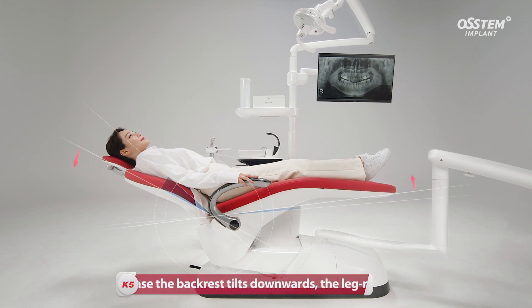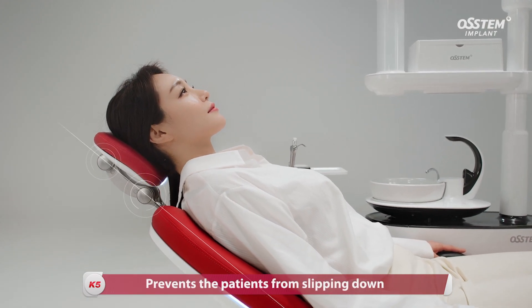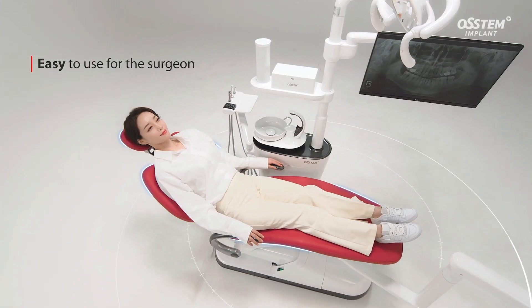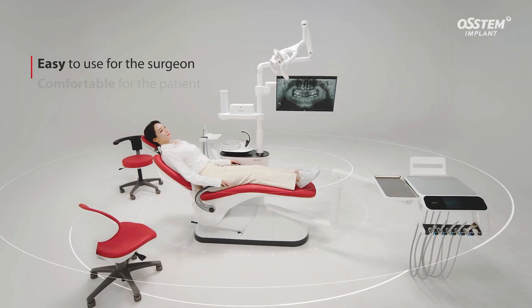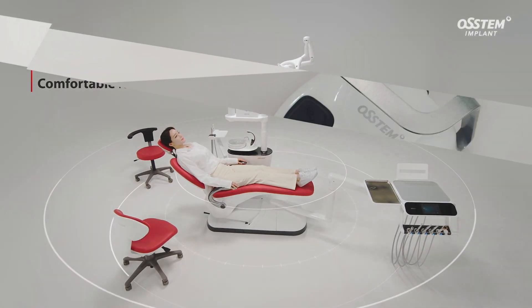When the backrest tilts downwards, the legrest goes up. This tilting function prevents the patients from slipping down. It is convenient for the clinicians to carry out treatments and provides comfort for the patients to receive treatments.